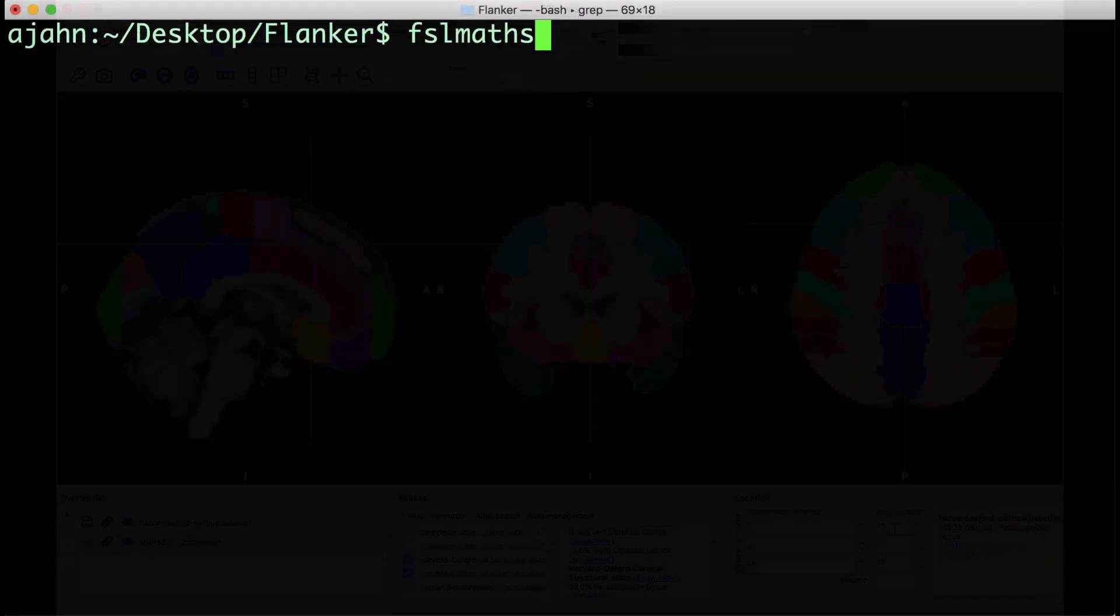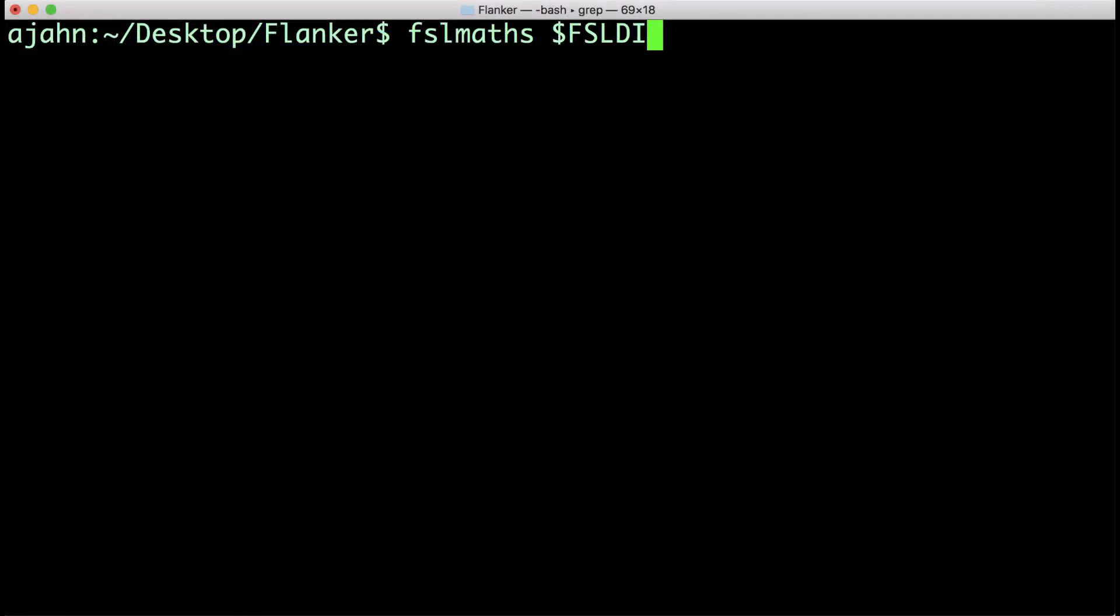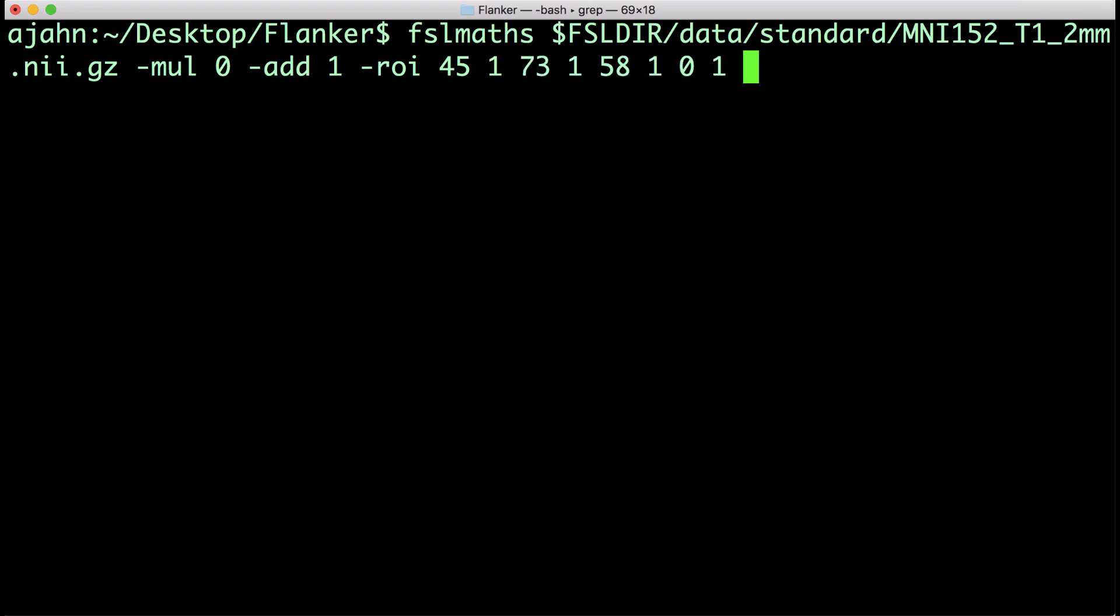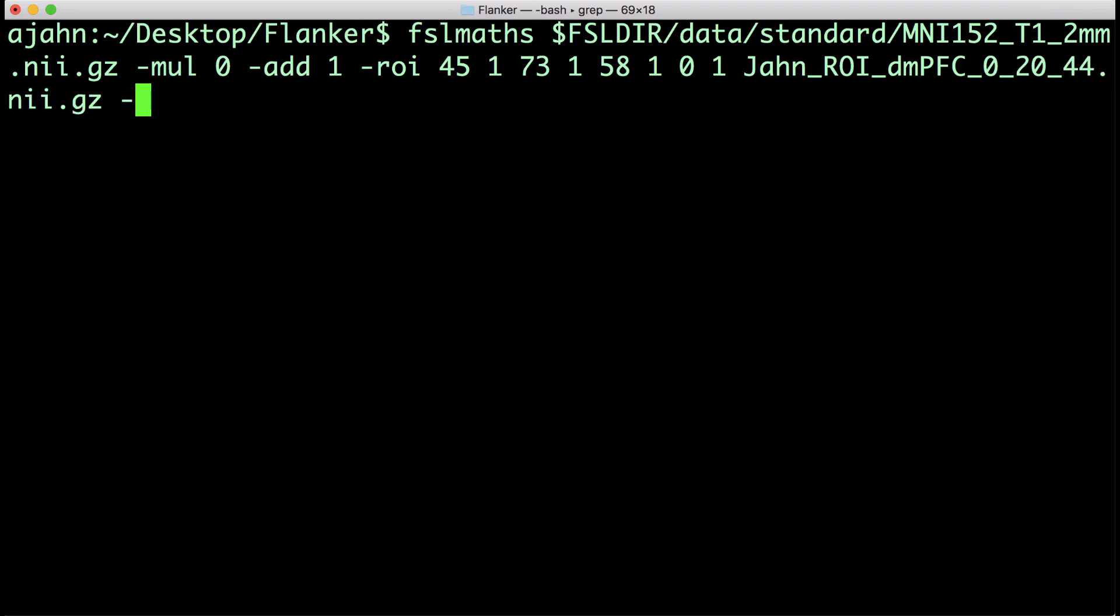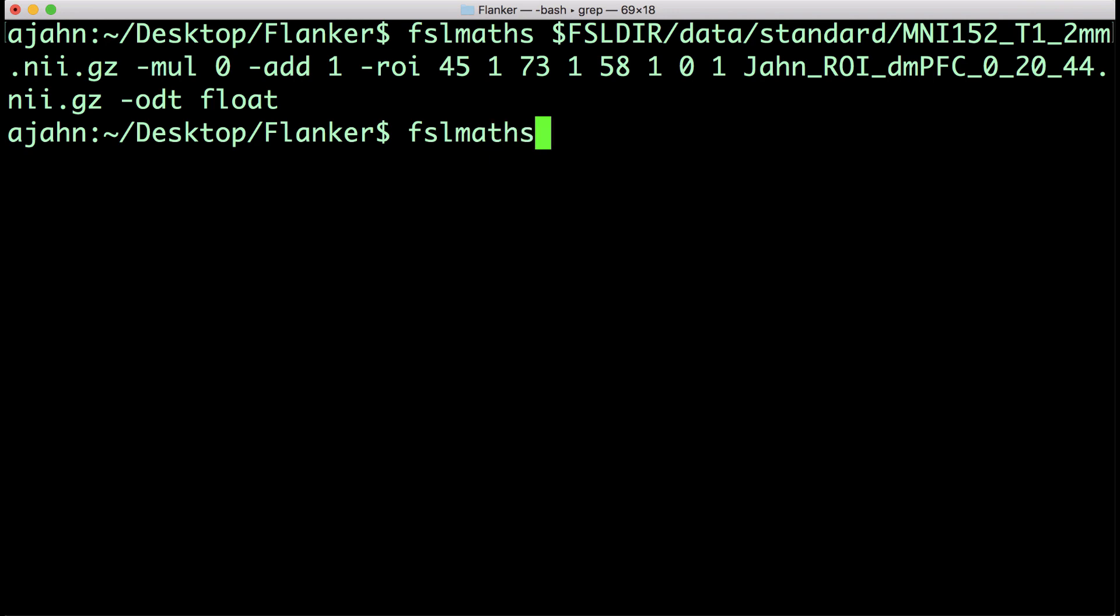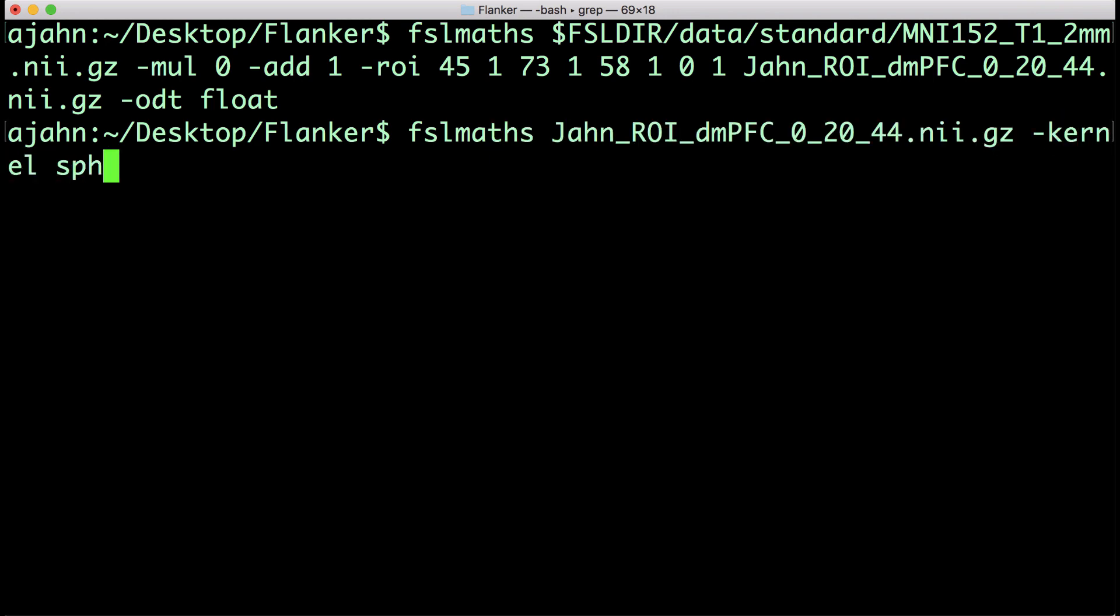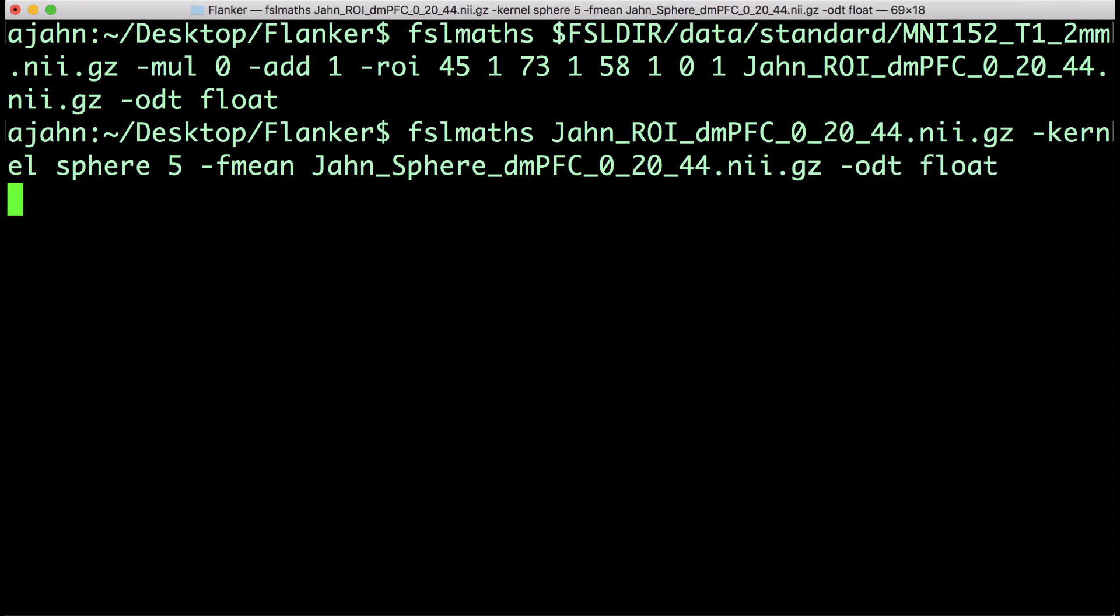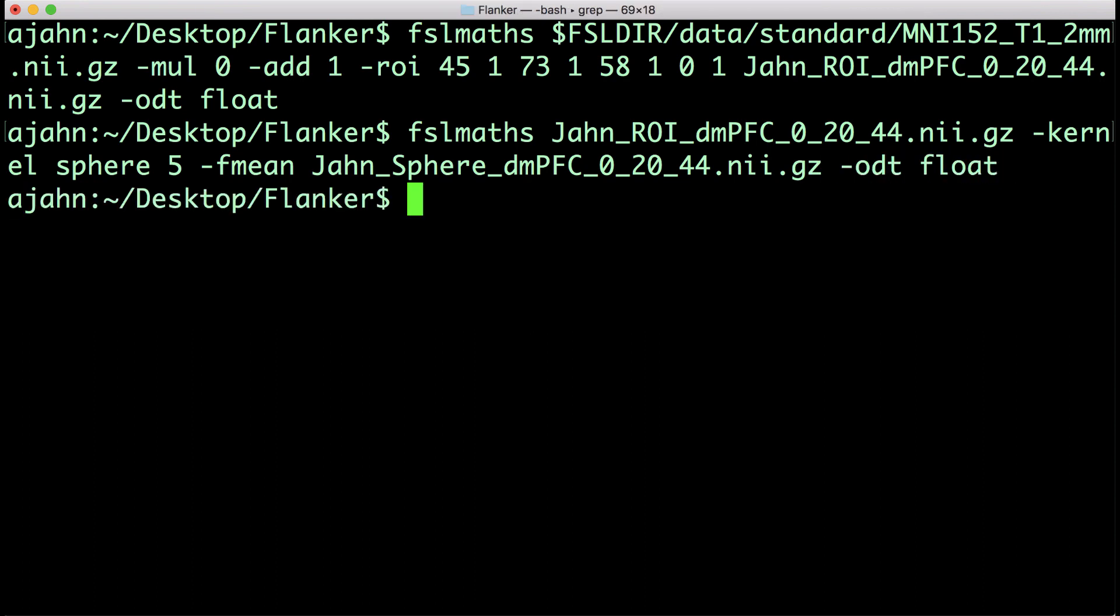In a terminal, type the following command. This is a long, dense command, but for now, just note where we have inserted the numbers 45, 73, and 58. What this command does is create a single voxel that we will use as a base for the next command. This command now expands the single voxel into a sphere with the radius of 5 millimeters and labels the resulting sphere as YAN Sphere DMPFC 02044 to indicate the coordinates.